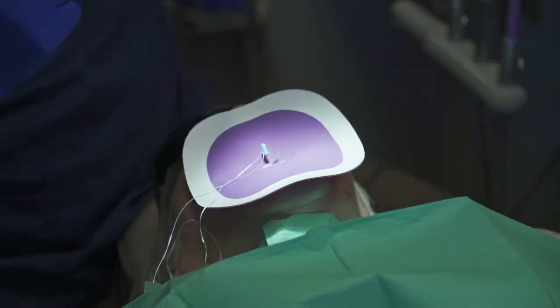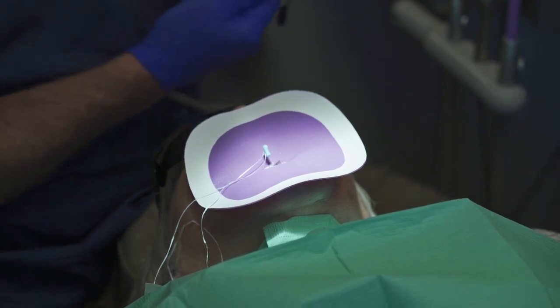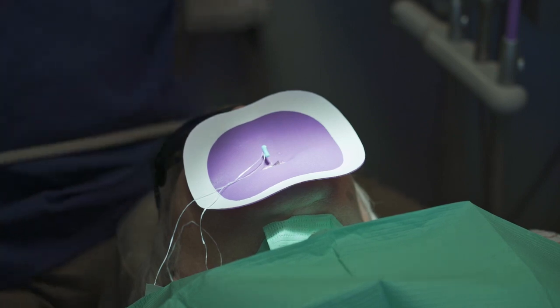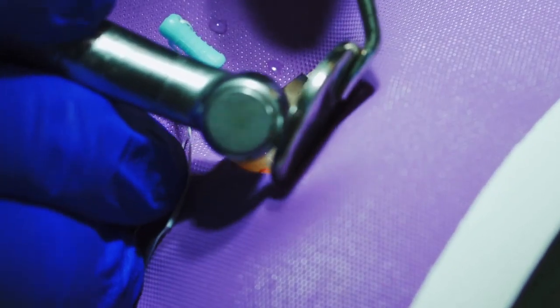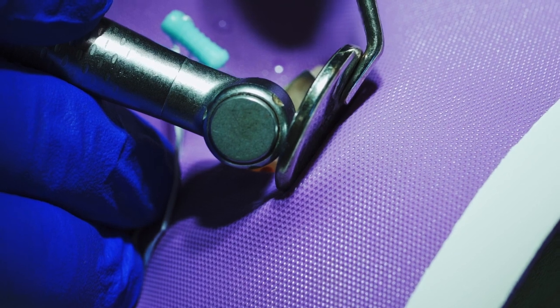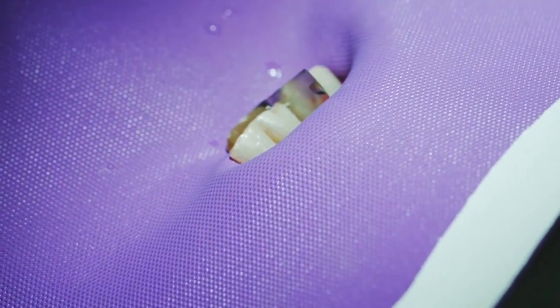To trim the glass pin, we use the same burr that we used to make the initial hole. All we need to do is score the edge, and then it immediately removes to the proper depth we'd like for this restoration. You just have to score it just a little bit — there it is.